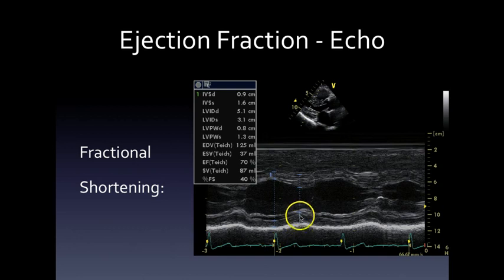Now, it's meant to be somewhere towards the end of the T-wave, but honestly, the best thing to do is eyeball it and make sure you get the thickest piece. When it's a beautiful, clear tracing like this, it becomes relatively easy. However, I will challenge you. Where did I put the cursor in the right spot here? Would you put it here? Okay. So again, it's down to experience.